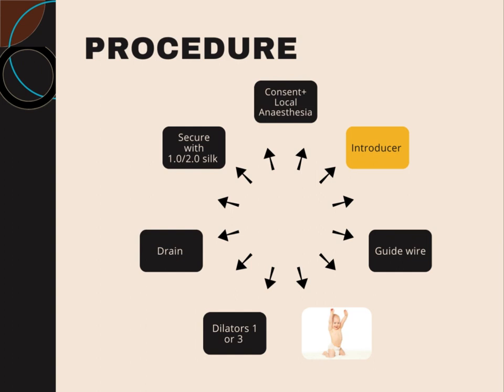For dilations, pneumothorax would normally have one dilator, because it's only a 12 French intercostal drain which we are inserting. So it's only one dilator, which we insert and dilate in clockwise and anticlockwise directions and then insert in. While for pleural effusion and empyema, there are three dilators, to make a wide bore tunnel. For the 18 French drain, we just insert the 18 French drain.